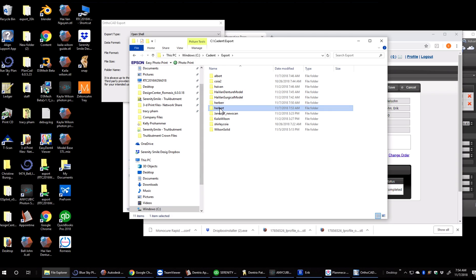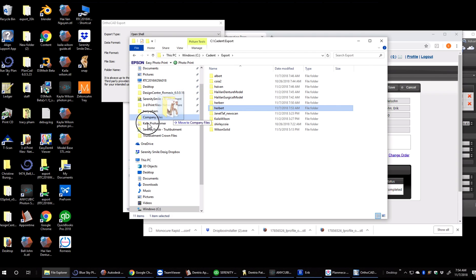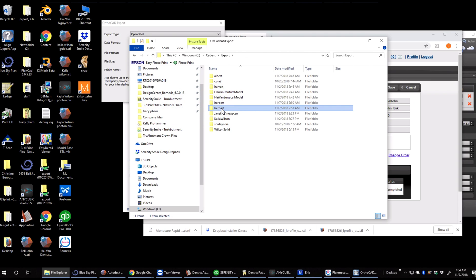So at this point, here's our folder with all the files inside it. Basically from here we can drag that to wherever we need to.